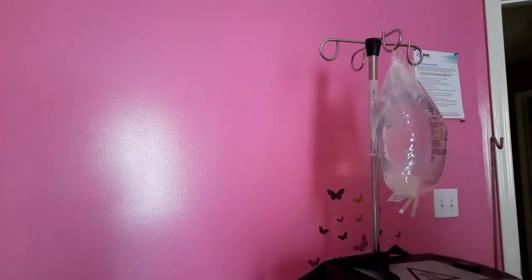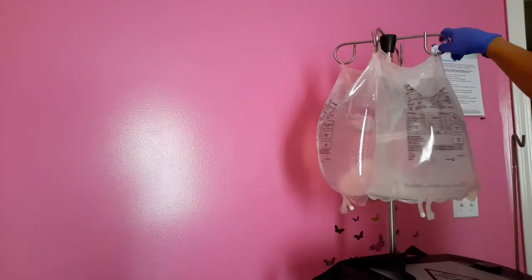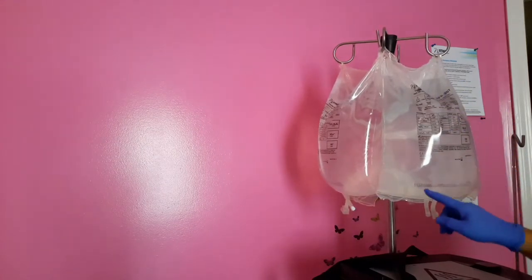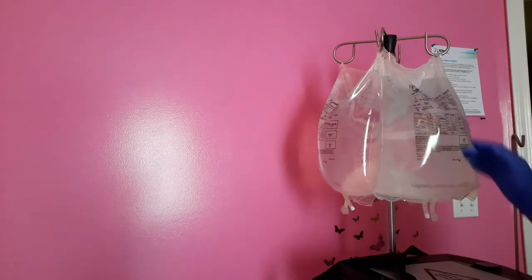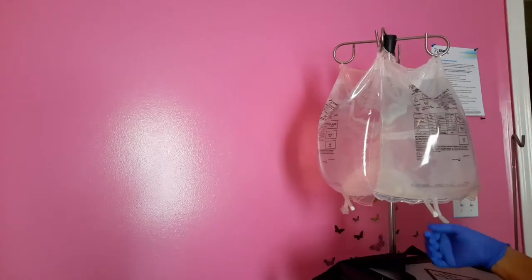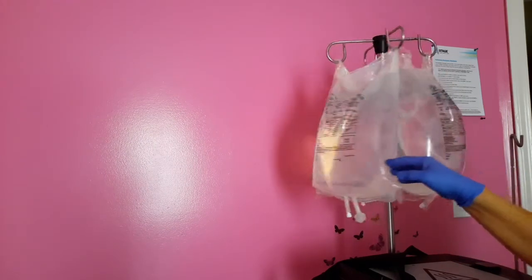All right, so I'm going to hang up all three, and I'll be right back. All right, you can see I have all three bags hanging up. It's important you have the writing facing you, that way you can always see the dates just in case you missed one, and always facing the same direction. That way your ports are always in the same order: cap, wings.